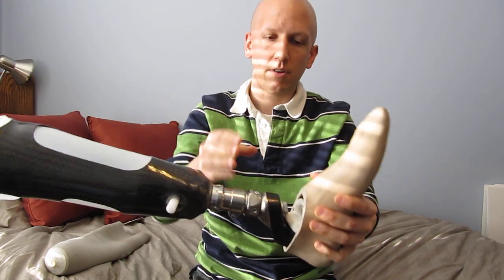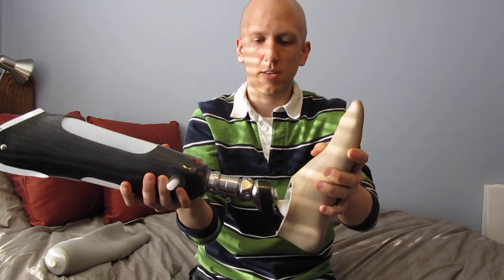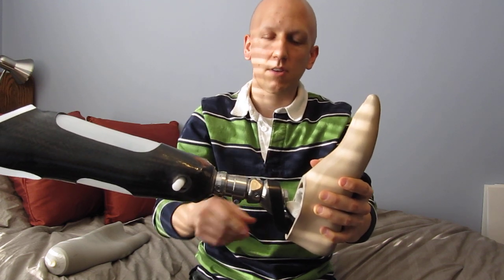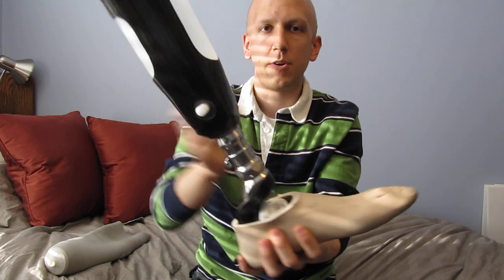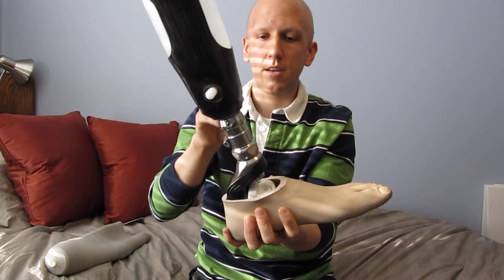The ankle is aluminum and carbon fiber. It's flexible, which makes it easy to walk with, and the ankle is pretty interesting. You see these four screws — these screws allow one to adjust the angle of the ankle, and how it works is kind of nifty.